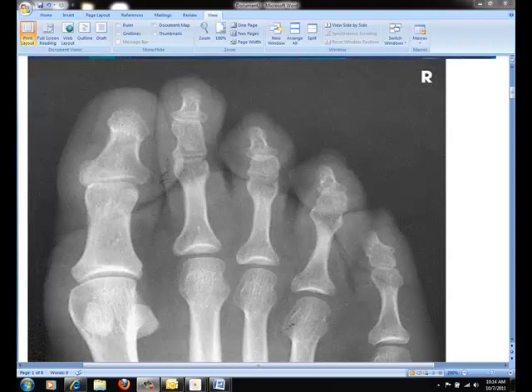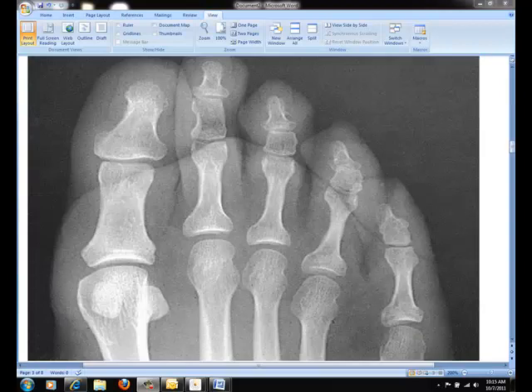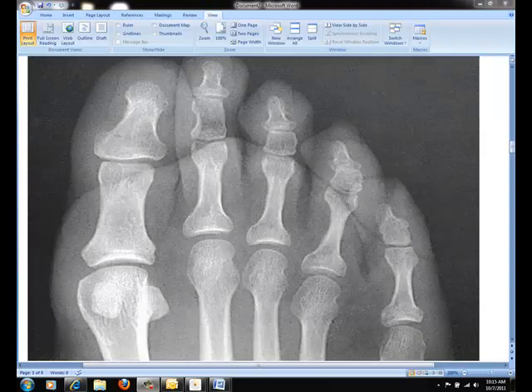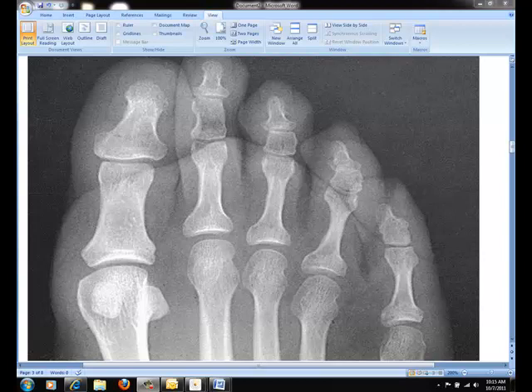Now compare this image to the following image, which demonstrates the opening of the IP joint spaces. This image was used to open the joint spaces by using a 15 degree posterior central ray angulation.